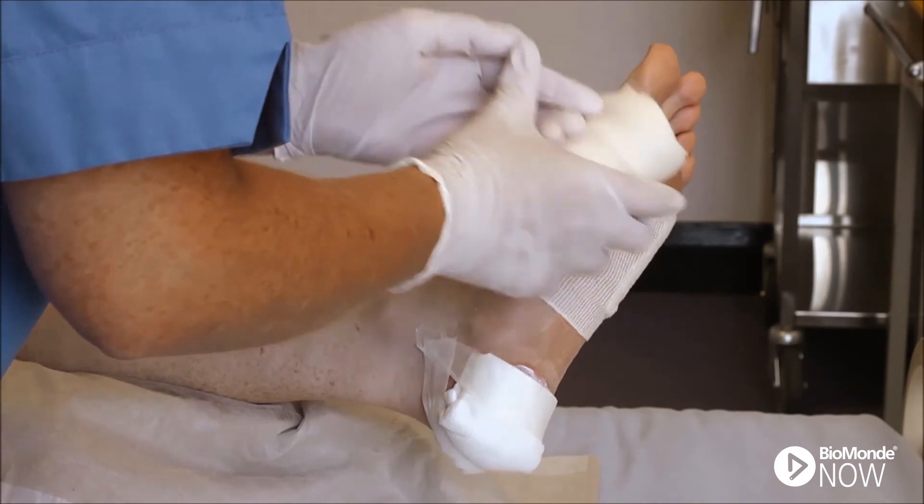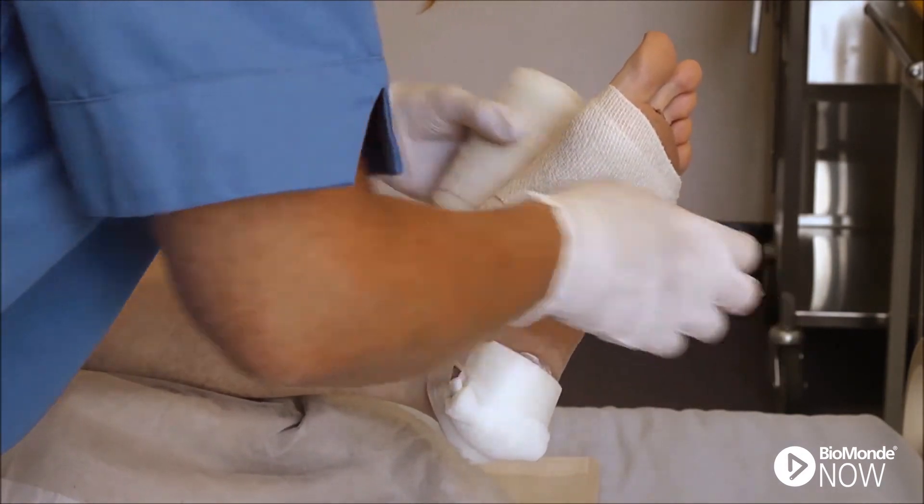Secure the outer dressing in place using tape or a non-occlusive dressing such as a bandage or stockinette.